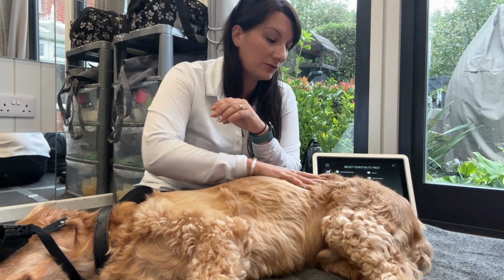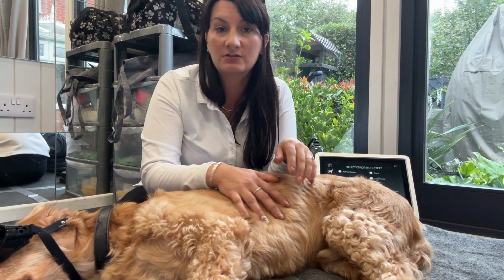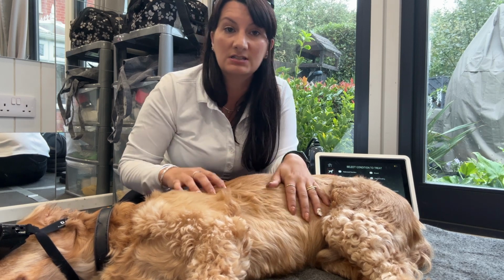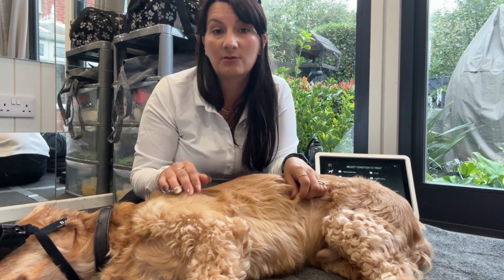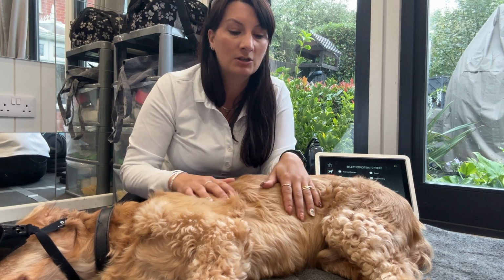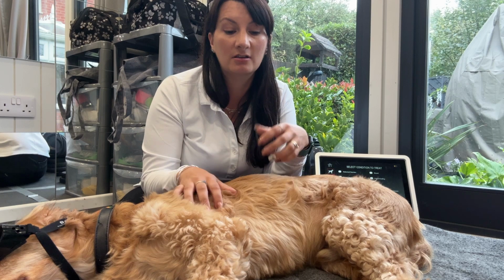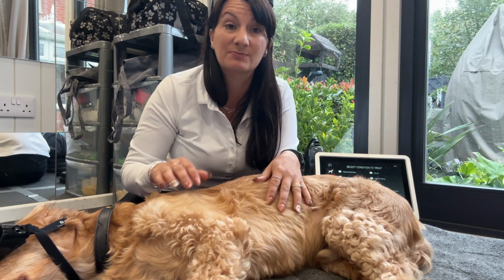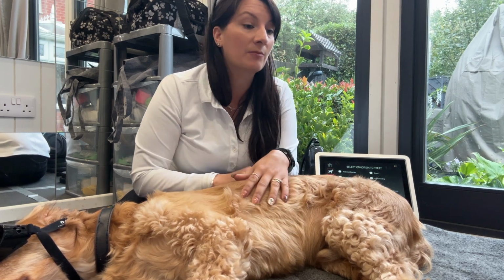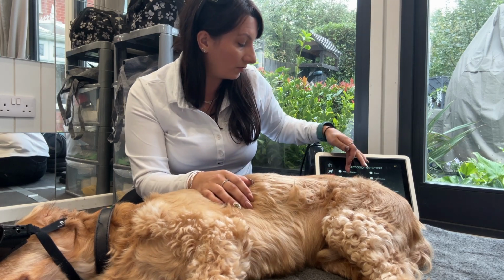And, you know, we've talked about it in the past with dose rates. All the different conditions have different doses, so it's really important to make sure you keep up to date with recent changes. As more and more research comes out, we're finding that we're seeing dose rates increase, particularly for deep tissue chronic issues. So being aware of all of that.